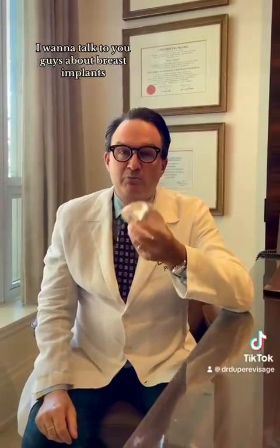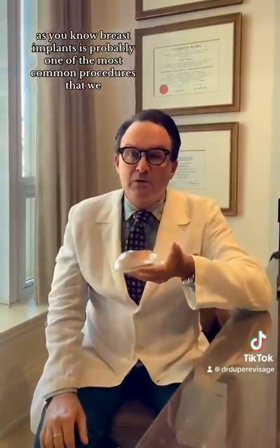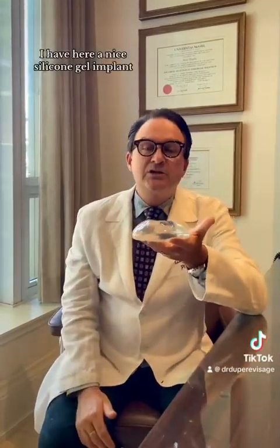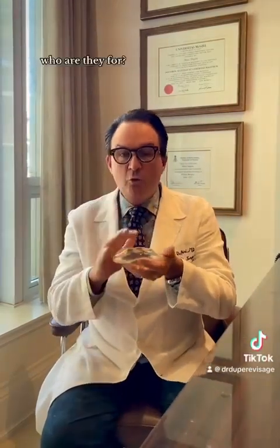Thank you for joining. I want to talk to you guys about breast implants. As you know, breast implant is probably one of the most common procedures that we plastic surgeons perform. I have here a nice silicone gel implant, the so-called gummy bear implants. Who are they for? First question.